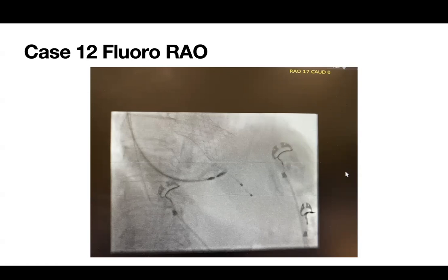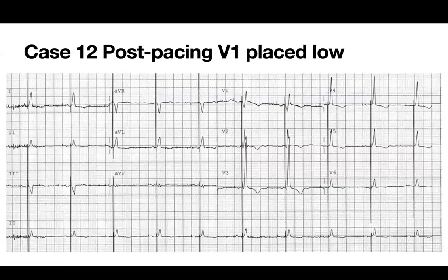And if you're obsessing about getting an R prime and you end up perforating, I was thinking I might as well put it low and see. I've seen a signal in some patients, it's not in everybody, but in some anatomies, depending if you're basal. The other hint I find from the ones that were like that, can you go back 2 slides on the ECG? If you see a very rapid transition to a V2 that's positive and you have nothing, go back 1.